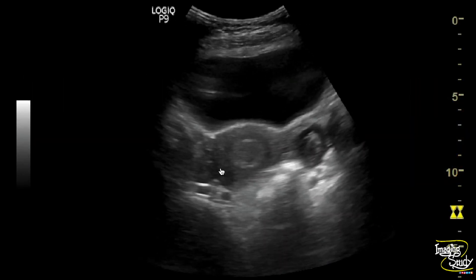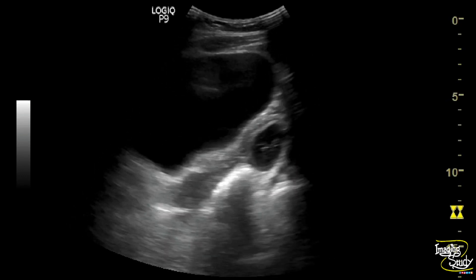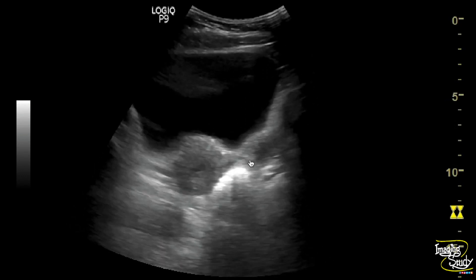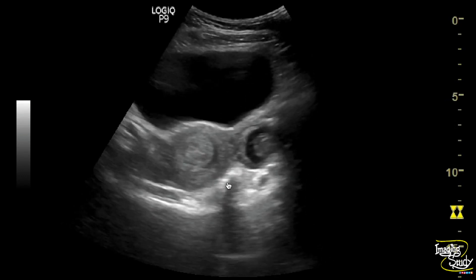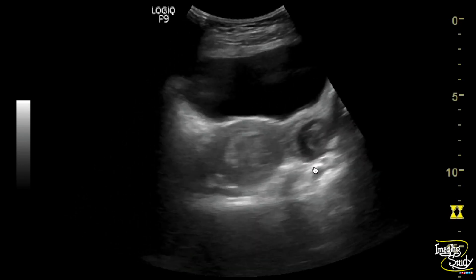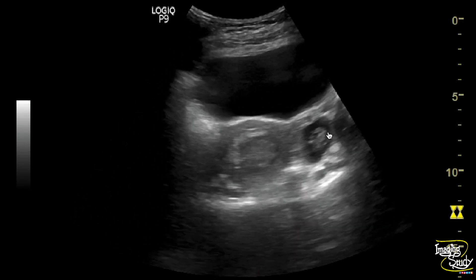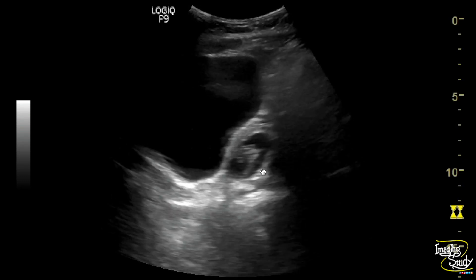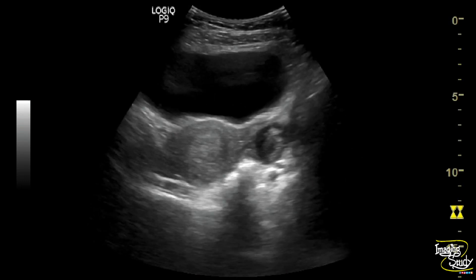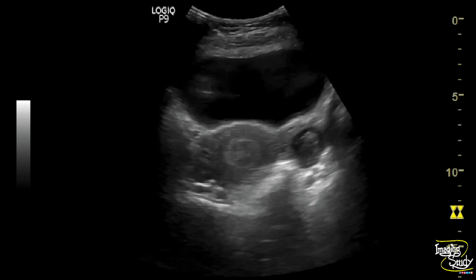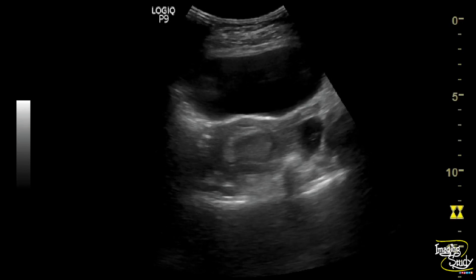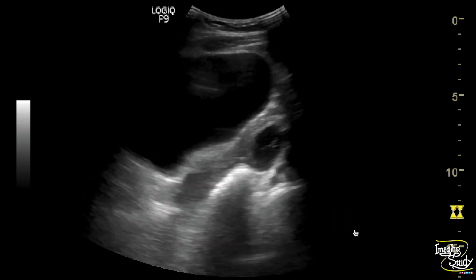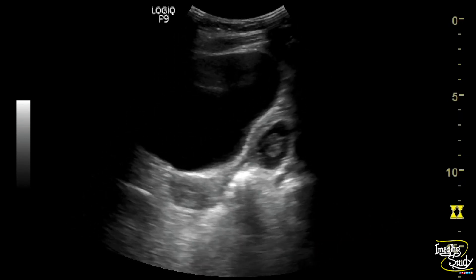Here on the transverse section, you can see the endometrium appears thickened within the uterus. And here on the left adnexa, you can see a cystic area — that is a gestational sac — and inside that you can see an embryo. I can't see any cardiac pulsation within it. The left ovary could not be separately visualized. So this was a case of ectopic pregnancy. There was no collection at the pelvic region, which indicates that the sac has not already ruptured.